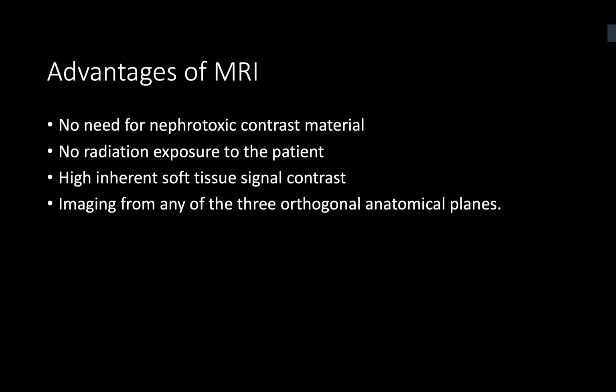And compared to other images, what are the advantages of MRI scan in prostate? So MRI scan gives excellent tissue resolution and differentiation between different tissue types, allowing for better interpretation. And the different phases as well will also help in the diagnostic accuracy of prostate cancer. All right. Is DCE or dynamic contrast enhancement phase important in MPMRI?